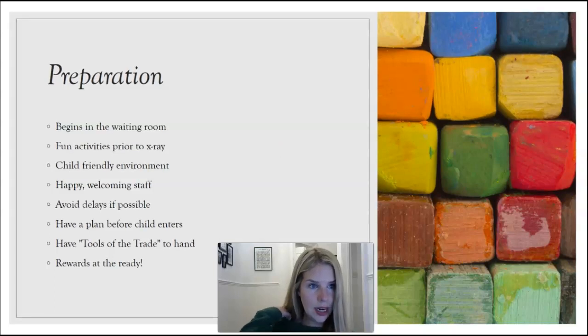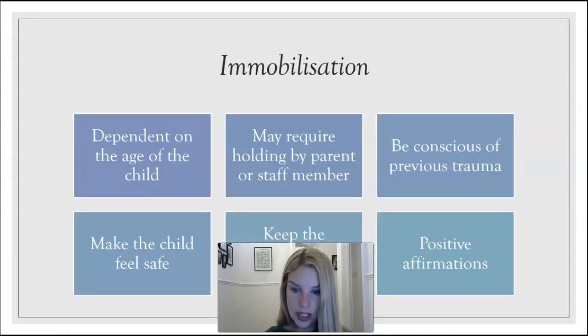Okay, so in terms of immobilisation, it really just depends on the age of the child.